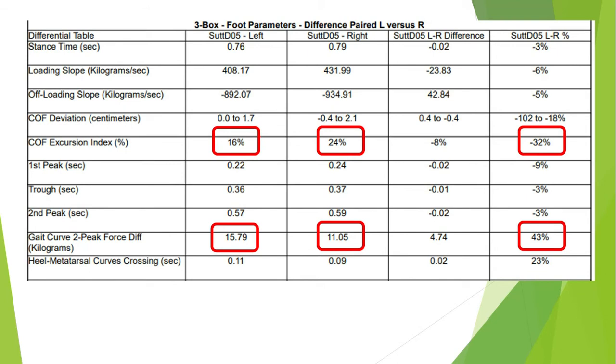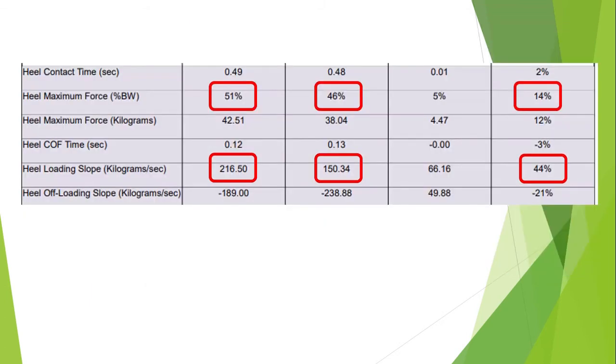Then we can actually go into what we call the foot parameters box. And these tables tell us all about the center of force excursion index and the variables. As you can see, there's a 32% difference from left to right in center of force index. You can see the peak pressure, there's a variation. And as we scroll down to looking at what's happening in the heel, we can see that there is a heel maximum force percentage of body weight, 51% to the left, 46% to the right. And the heel loading is coming off at a different angle also.